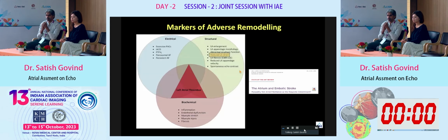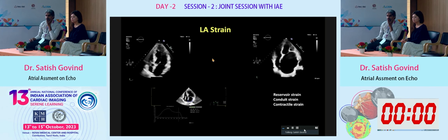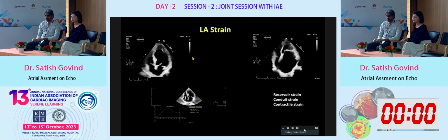Now, with the advent of strain, which Dr. Shanmugam nicely pointed out, we have a newer tool to look at the LA. And this again is now a dedicated software which was not available before. So it is a very quick and easy way of doing the LA strain. A lot of interest now, a lot of people are looking at it, a lot of focus on it. There's a lot of clinical value being associated with it. So it's very simple, a typical 4-chamber. And you can see that there are different types of atria. You have a giant atrium over there and you have a moderate sized atrium. So just a quick acquisition and the software gives you 3 values: reservoir, conduit, and contractile strain. That's how the LA is looked at with LA strain.